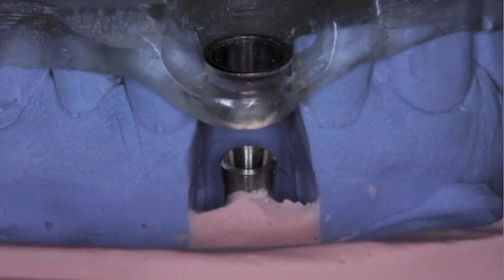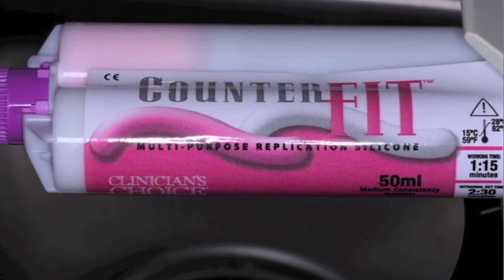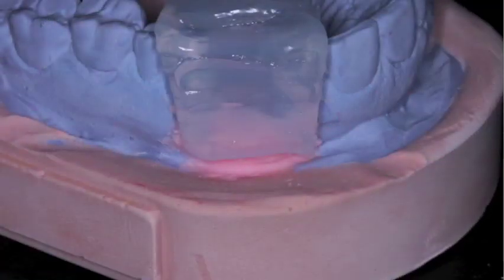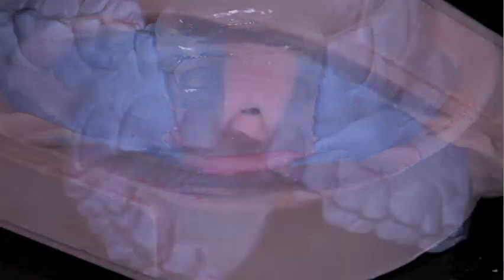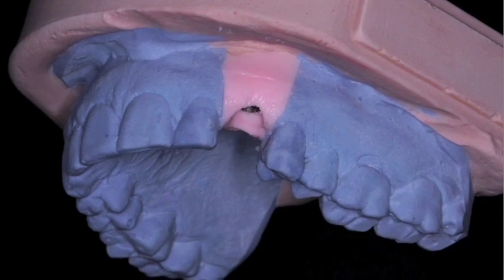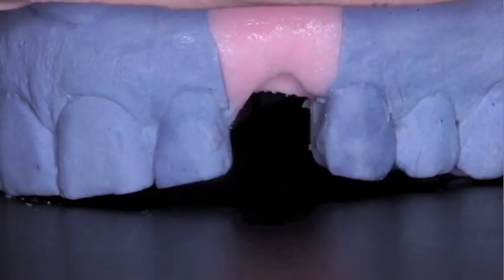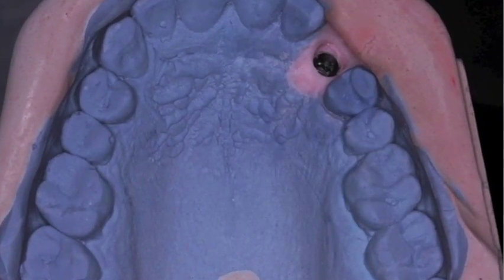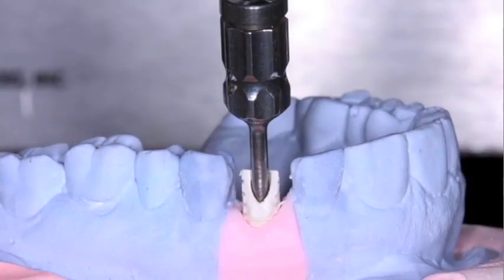You can see the implant being placed here at tooth number 11. We use a silicone to replace the soft tissue. With this silicone in place, we can actually contour the tissue, simulate the surgery entirely before it's done, and create proper aesthetics and emergence profile.